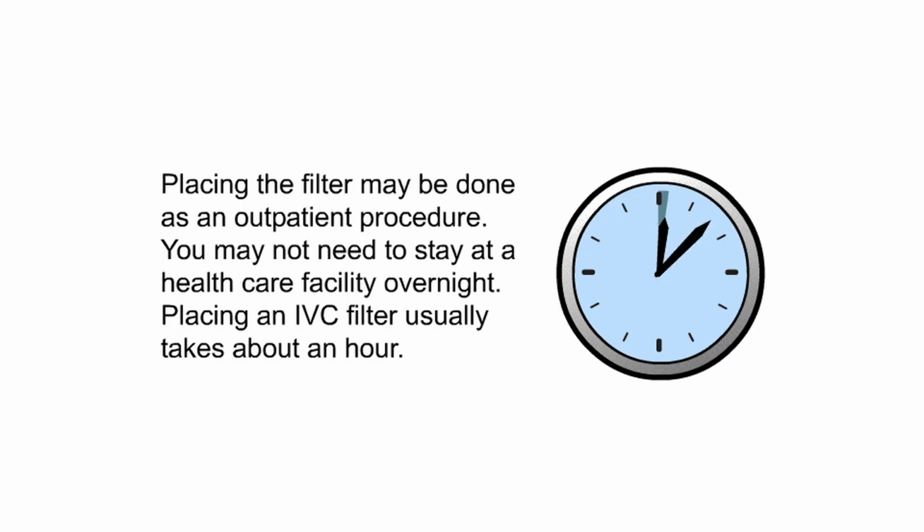Procedure. Placing the filter may be done as an outpatient procedure. You may not need to stay at a healthcare facility overnight. Placing an IVC filter usually takes about an hour.